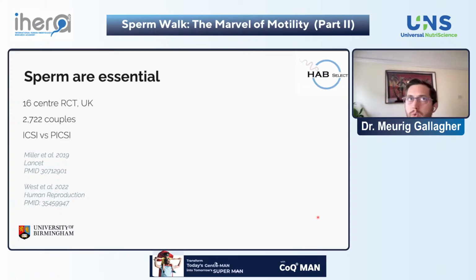In terms of the individual sperm, this is a study that we ran partly from Birmingham in the UK, called the HabSelect trial. This was a trial comparing standard ICSI practice to PICSI. For those of you who don't know, PICSI is exactly the same as ICSI, except you select a sperm that binds to hyaluronic acid. Mature sperm have an HA receptor on the head of them. You swim them over a little dish that contains a coating of HA. The ones that bind, you select one of those and inject it into the egg. This was almost 3,000 couples across 16 centres in the UK.